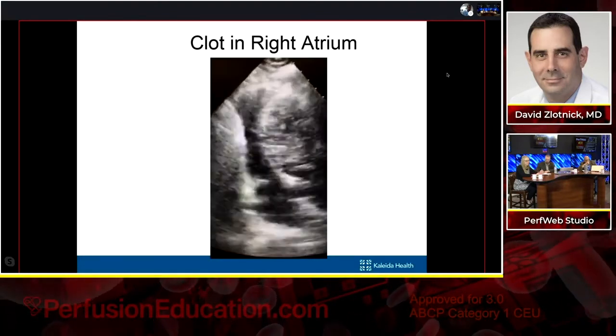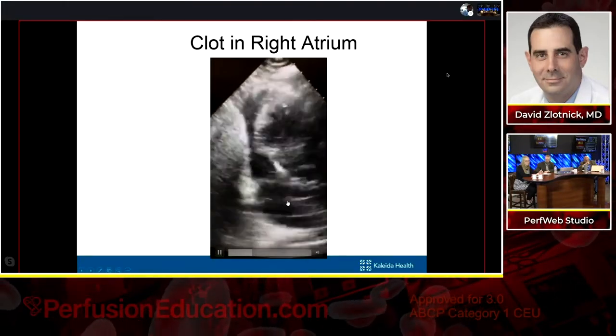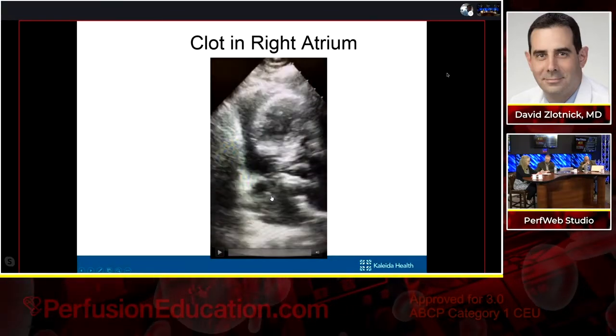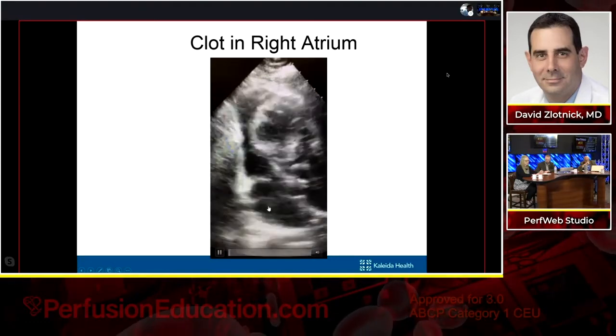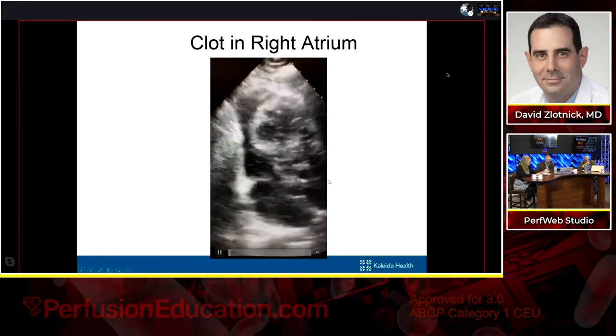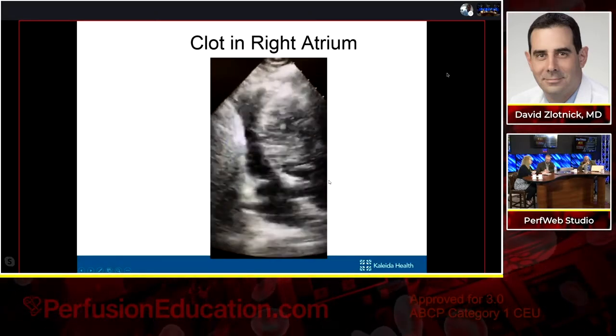And hopefully this is projecting. I know this is a little bit blurry, but if you take a look here, this is the right atrium and the right ventricle, and the left ventricle is tacking away. But you can see right in here, when this is playing, let me play it again, there's basically a tumbling thrombus in the right atrium that's going across the tricuspid valve. Yep, we'll see it. Play it again.